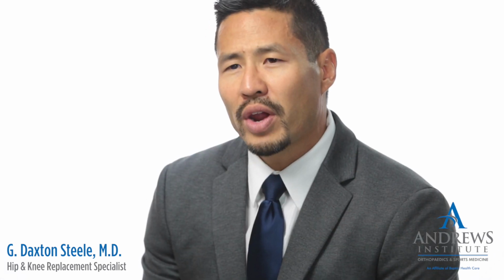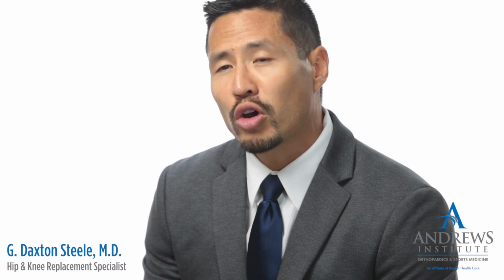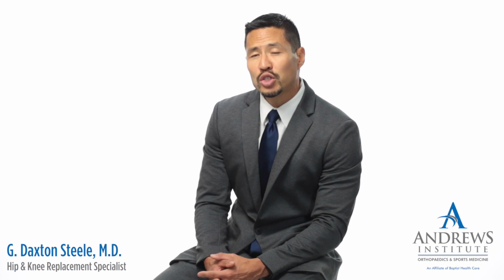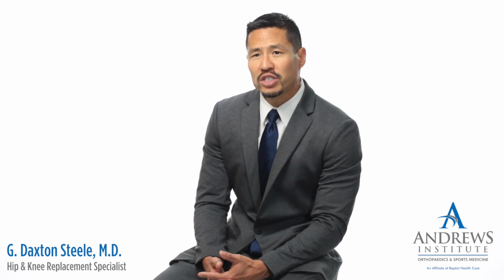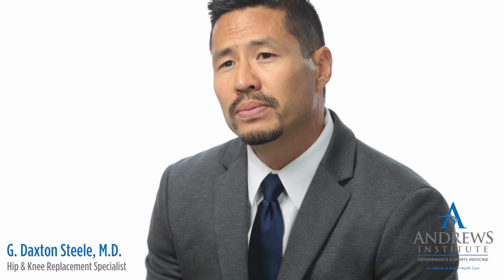Well, it's a clinical and radiographic examination that determines whether you're a good candidate for a partial or a total knee replacement. Basically, if your arthritis is isolated to one of those compartments and your symptoms are consistent with that same type of arthritis, you're usually a candidate for a partial knee replacement as opposed to a total knee replacement.